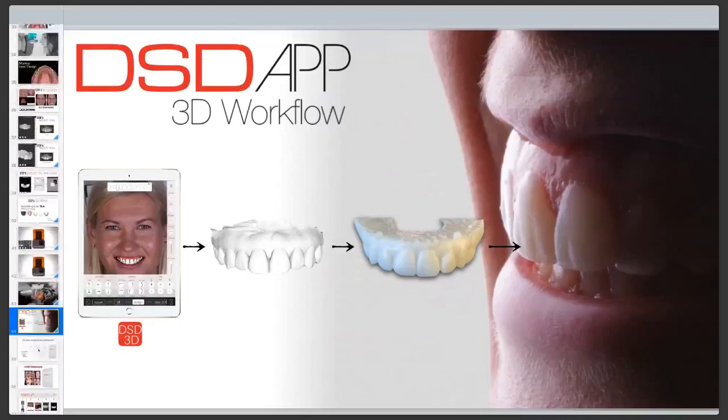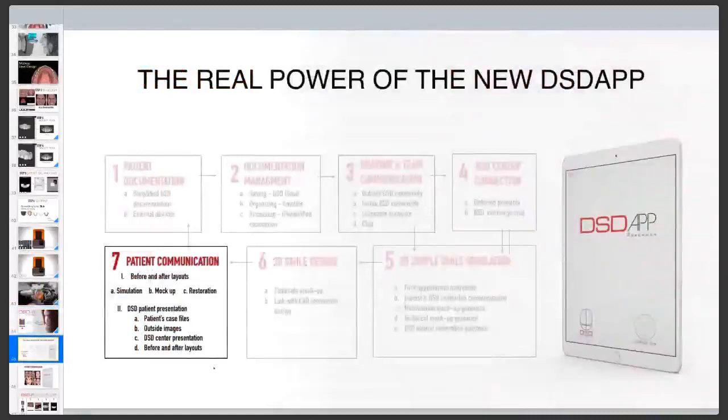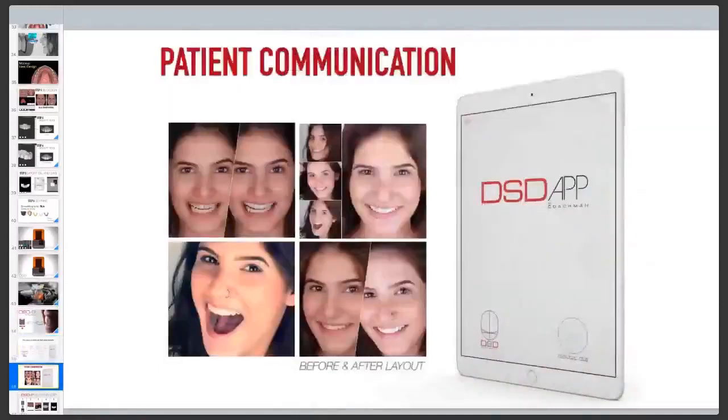And last but not least is the patient communication. So the app, as you know, helps us create before and after photos and videos to motivate our patients. And we can also create a presentation inside of the app, like an emotional presentation after the mock-up, right? To present the case to our patients. So we can do all of this inside of the app. We also have webinars showing and demonstrating how to do this. So if you'd like to learn more, check webinar number 4.